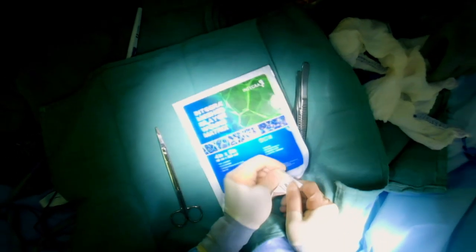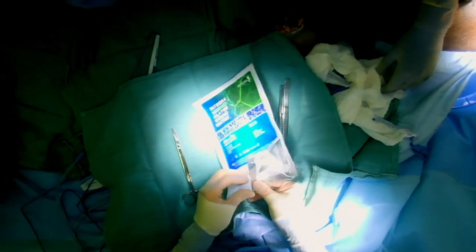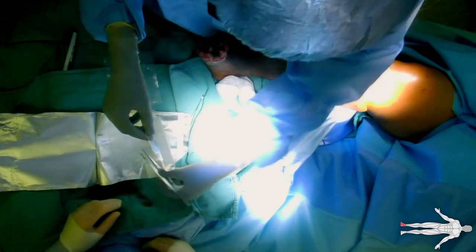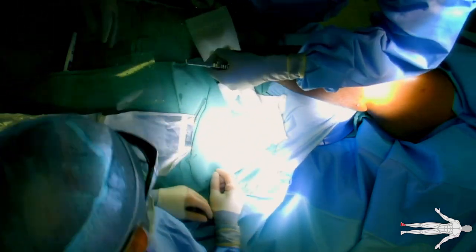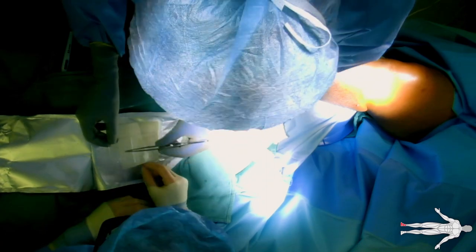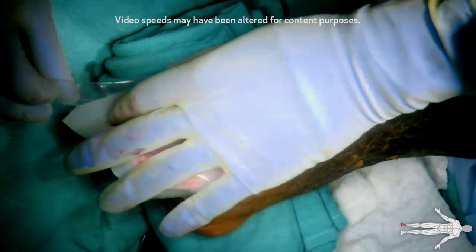Integra BioLayer Matrix is a dermal layer skin substitute. After wound debridement, thorough irrigation, and hemostasis, the Integra is prepared. It is taken out of its packaging and can be washed in saline prior to application. Its two layers are delineated: one smooth silicone layer and the mesh dermal layer. The Integra is placed over the wound with the smooth silicone side up.